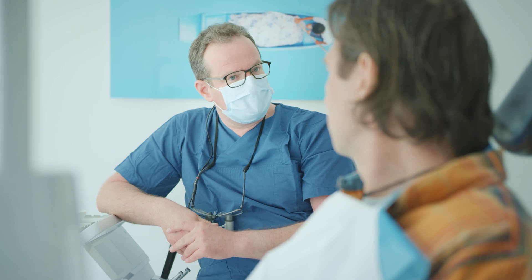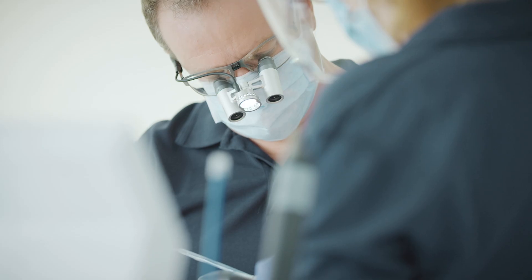By addressing these five major problems with digital dentistry, we can enhance the quality of care for our patients, streamline our workflows, and improve overall outcomes and quality of life for our patients. Sounds too good to be true? It isn't. The reality is this: our 4D workflow is highly predictable and precise enough to allow for cementing ceramic restorations upon try-in. This is obviously a great leap forward in saving time and boosting efficiency for us and for our patients.